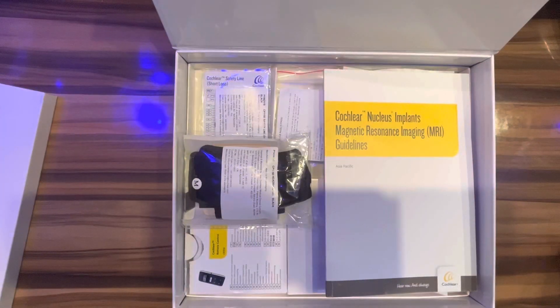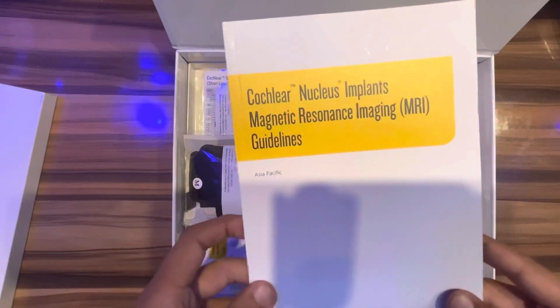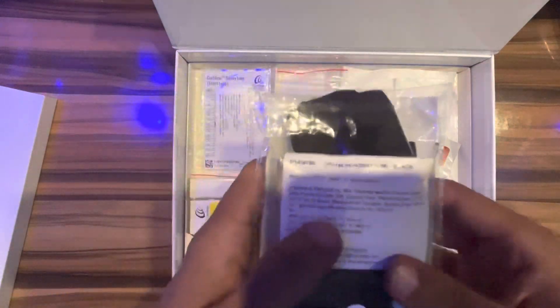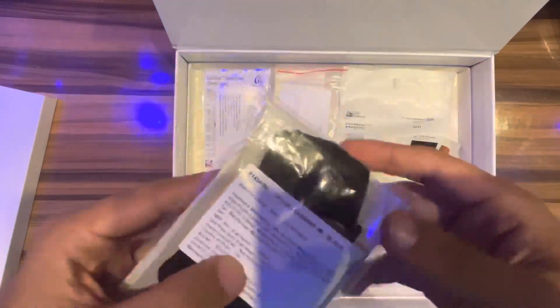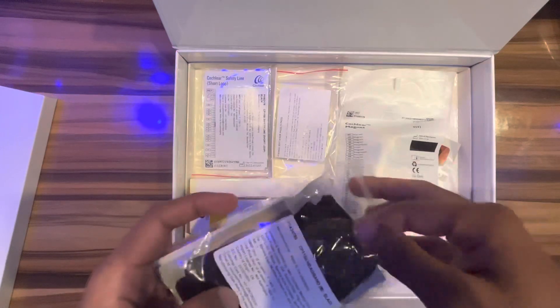Let's open this. There are a lot of items in the box. This is the MRI guideline. This is a headband — my size is a male M size.